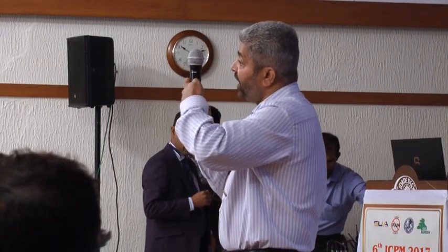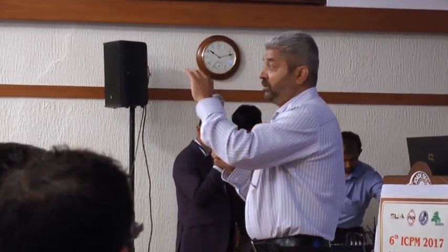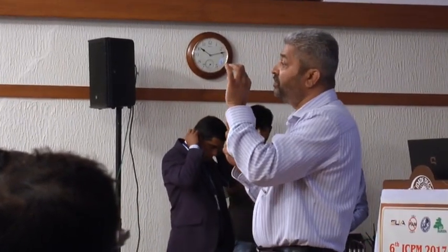Even the smallest of nerves, you can see that. You just move your hub once you approach the nerve, and if your needle is gliding over the nerve, that means it is outside. Also, you can have some appreciation of eyeball assessment of the nerve size. So the minute you see that the nerve size is increasing, don't ask the injector who is injecting the solution to stop, because then there's a thinking time and a stopping time.